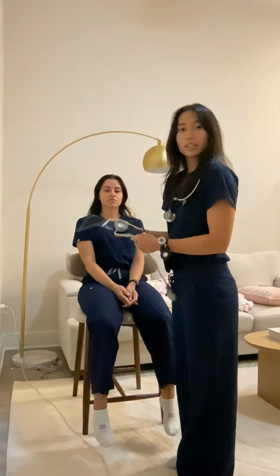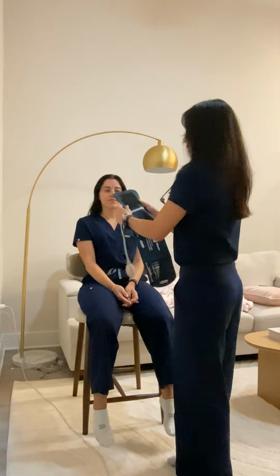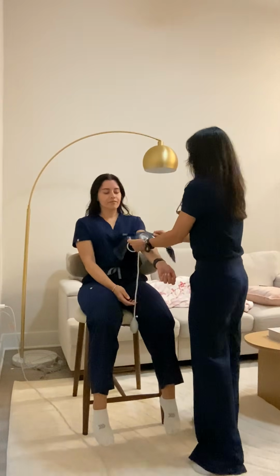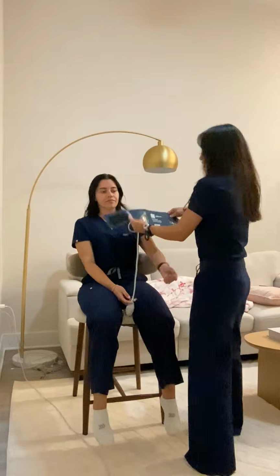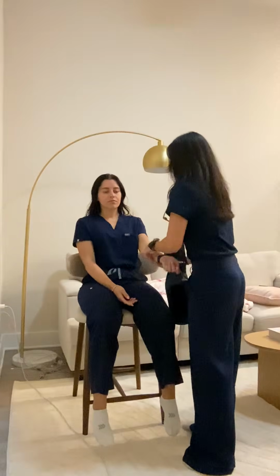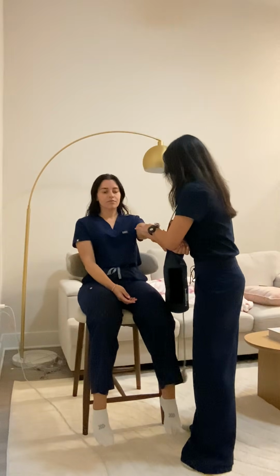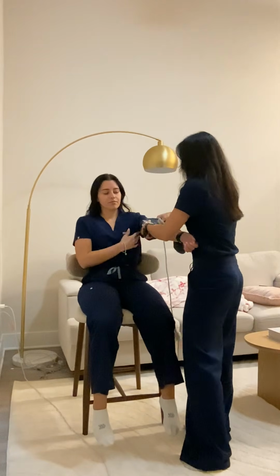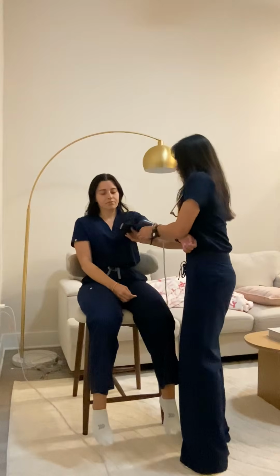Perfect. Next, I will assess the patient's blood pressure. First, I will grab the bladder of the cuff and ensure that the width of the bladder is 40% of the patient's arm circumference, and the length of the bladder is approximately 80% of the arm's circumference. Then, I will palpate and feel for the brachial artery. I'll place the cuff 1 inch above the antecubital fossa, ensuring that the artery index marker is aligned with the brachial artery.